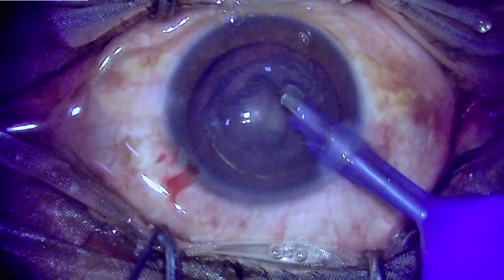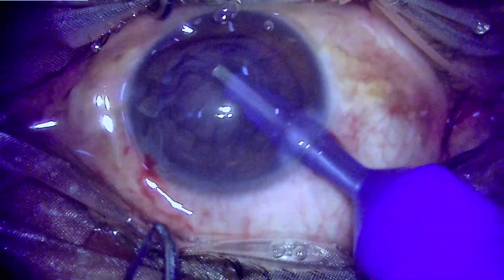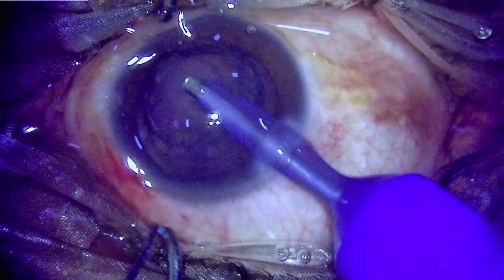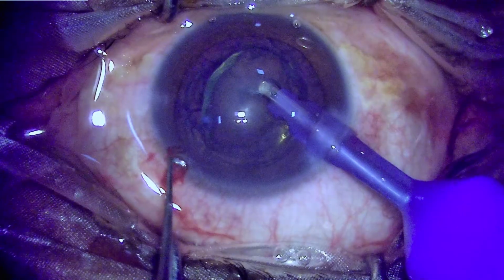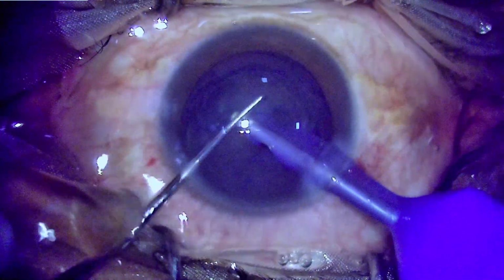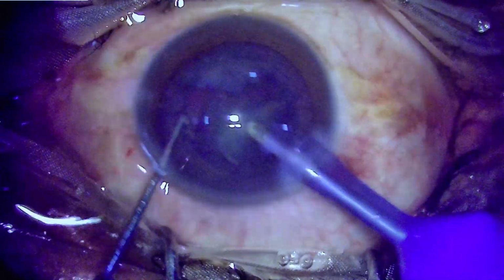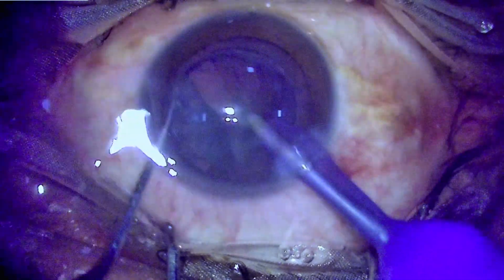Removing the overlying cortex so as to bare the nucleus, and we can see the bevel is down. The chopping maneuver can be done with bevel up or bevel down, and it has been proved by a few studies that the primary chop is more effective if the bevel is down. So it's a choice. Bisecting the nucleus into 2, into 3, and then removing the pieces as they come to the phaco tip. So it's a soft nucleus.